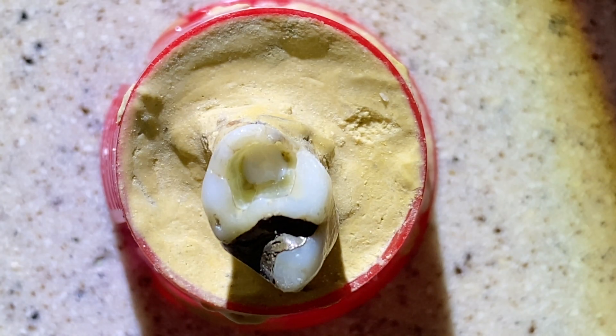And there you have it — the liner is applied. From there, we fill the rest of the tooth. That's a basic demonstration on how we apply our liners into a cavity preparation in order to help protect the nerve of the tooth and minimize sensitivity after the filling is placed.